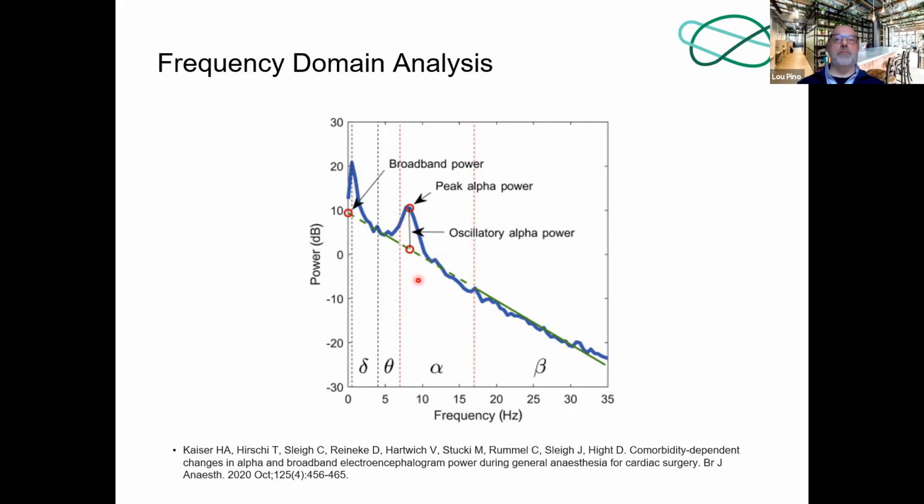In this diagram, we can see an oscillation at the alpha peak here. The frequency and power of the alpha peak differs across people. The function of alpha oscillations also differs depending upon where in the brain the signal originates.